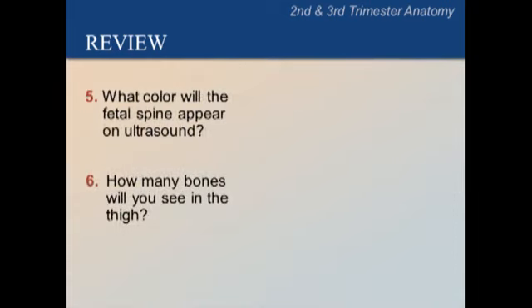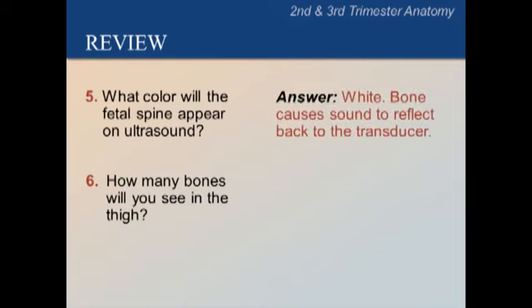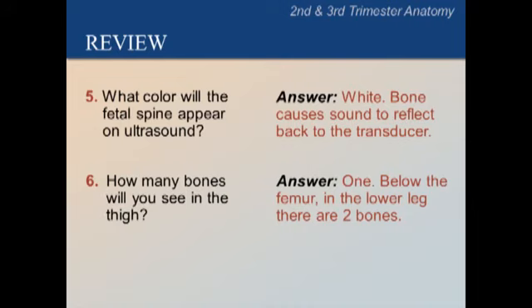What color is the fetal spine on ultrasound? The answer is white because bone causes sound to reflect back to the transducer. How many bones will you see with the femur? The answer is just 1. Below the femur, in the lower leg, there are 2 bones.